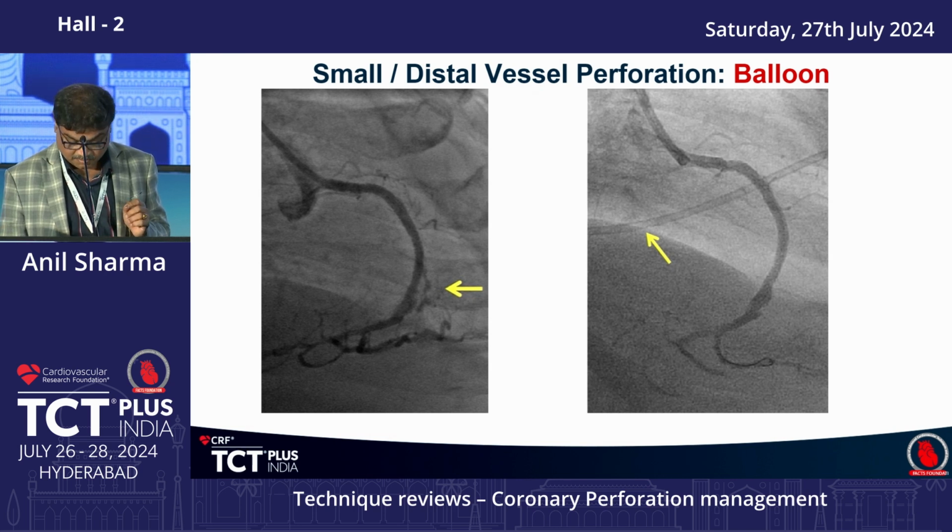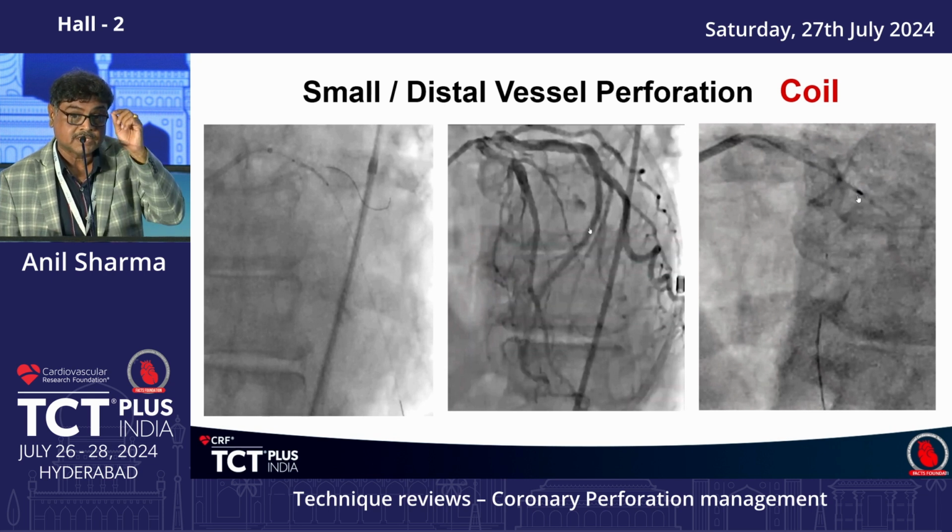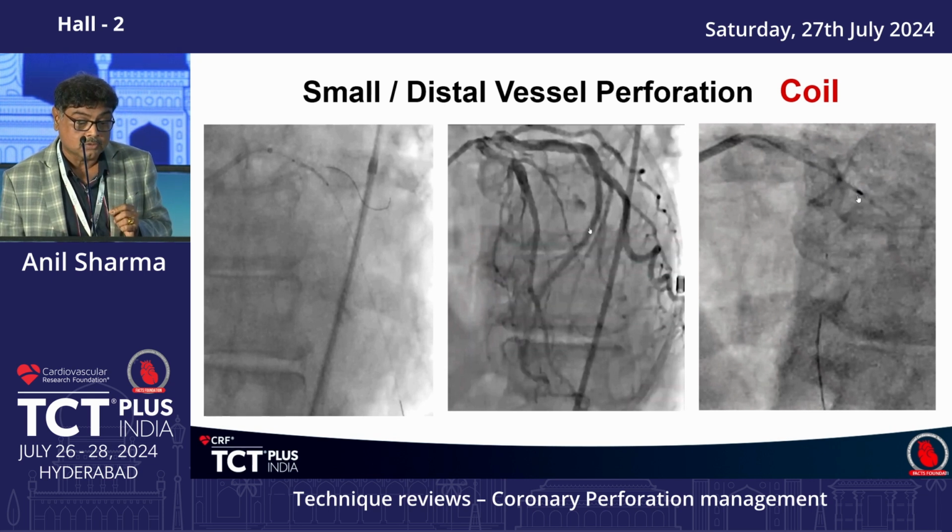Just settle with the balloon. Another case, LAD plasty. Again, concentration on the focus. Arjun ki aankh. Arjun, then machli ki aankh. Arjun dekh raha hai. So that is how. And then somebody, an assistant, should see what the diagonal wire has done.